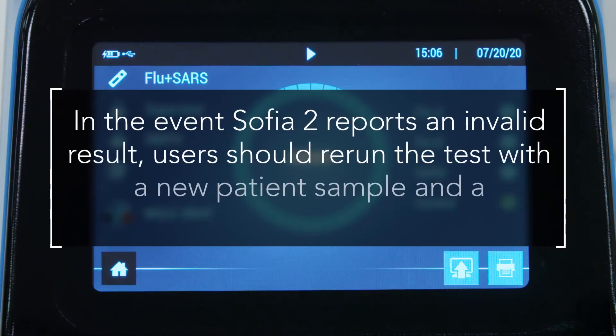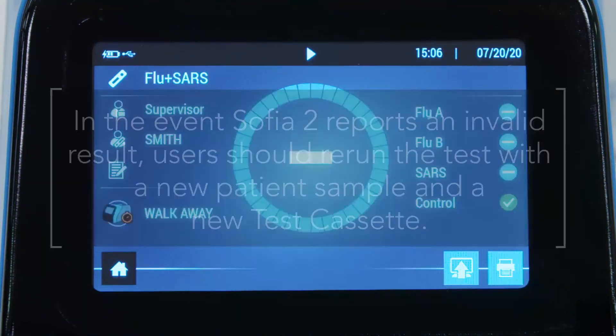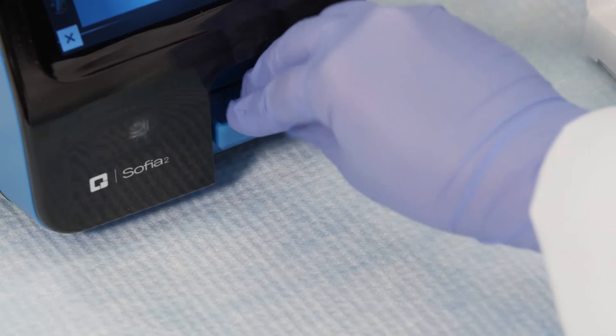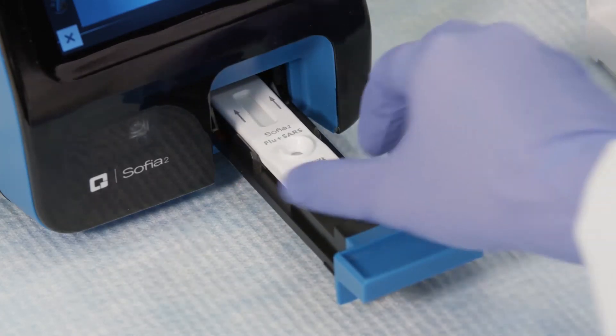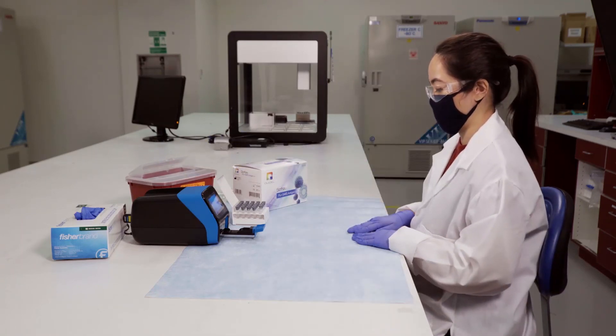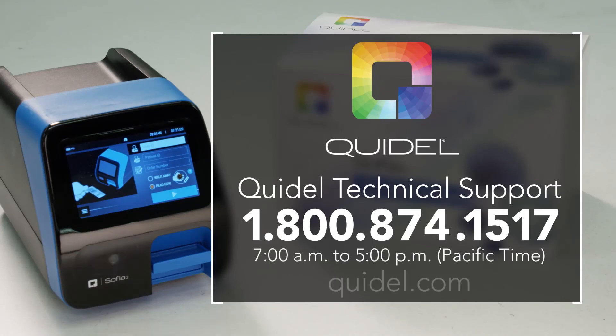In the event SOFIA2 reports an invalid result, users should rerun the test with a new patient sample and a new test cassette. Press home and follow the on-screen directions, then return to the run test screen. Discard cassettes in an approved biohazard container or in accordance with your institution's policies. For any technical support issues regarding SOFIA2 or SOFIA assays, users can visit Quidel.com or contact Quidel Technical Support at 800-874-1517.